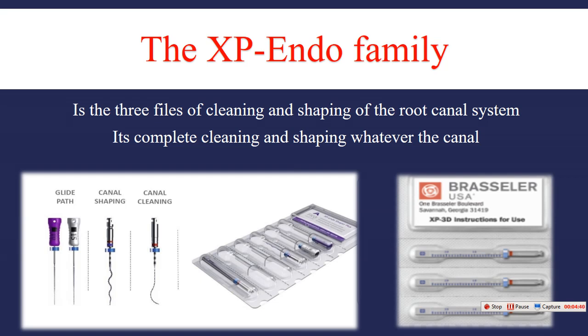Glide path is the principle of root canal treatment. Whatever improvement in the root canal system, glide path is the principle.